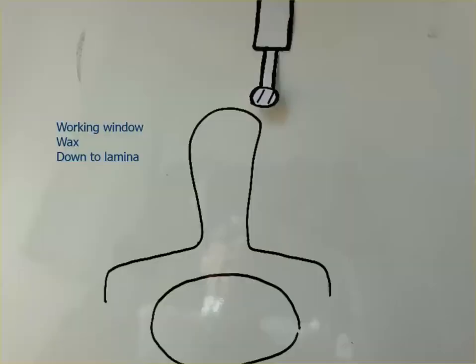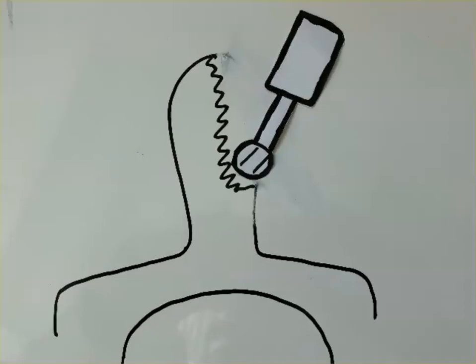Just intraoperatively, I put a clamp on the spine to confirm where we are. So the first step with the burr, and you're going to see this with the video, is you make a working window. So you start at the top and you drill the posterior spinous process. You're making a window basically to look through. So you start in the middle.